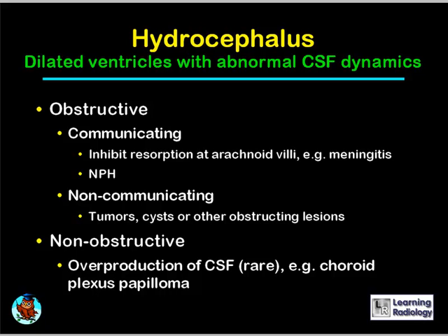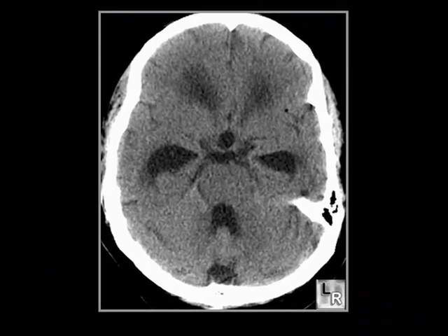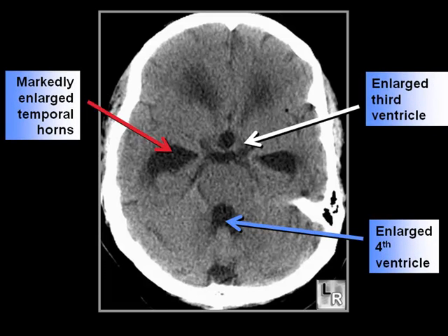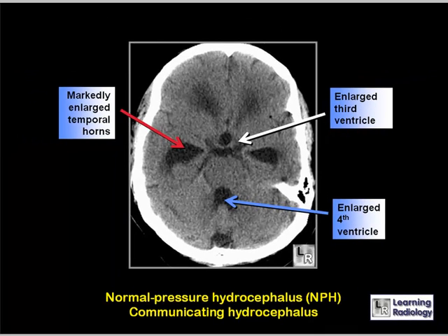The patient has markedly enlarged temporal horns (red arrow), an enlarged third ventricle, and an enlarged fourth ventricle, but the sulci are not enlarged. Given the patient's symptoms of staggering gait and incontinence, this is characteristic of normal pressure hydrocephalus, a form of communicating hydrocephalus.